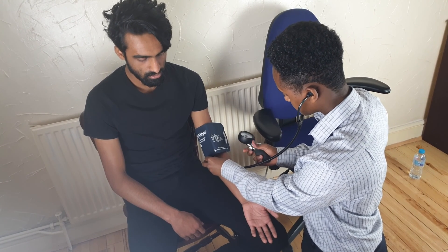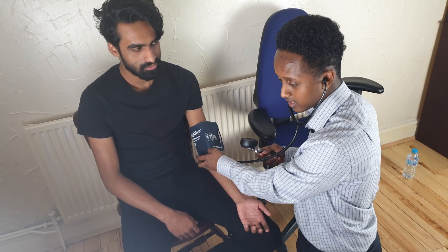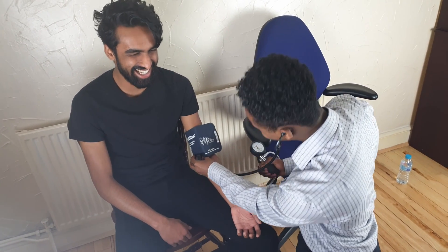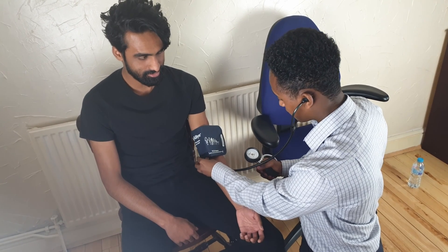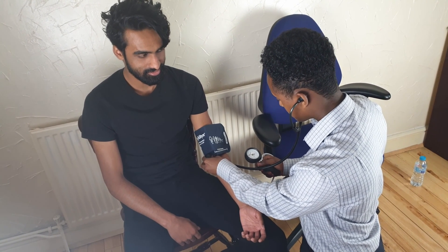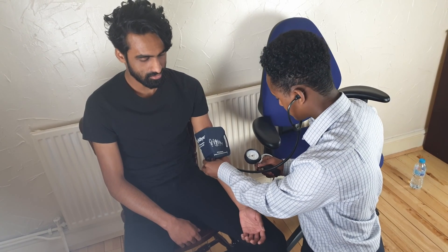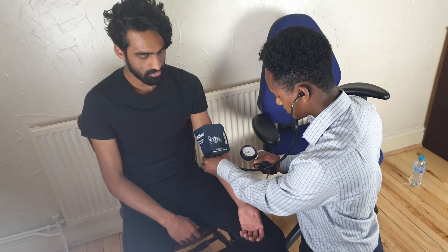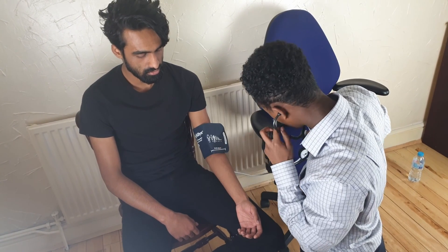Turn the notch as before and make sure you warn the patient because it can hurt a little, especially if they're slim. Inflate the cuff — I'm going to inflate it to around 140. I hear the systolic value around 120, which is a really good healthy systolic pressure. I'm going to slowly deflate the cuff until I don't hear the sounds anymore. The blood pressure for Nick today was 120 over 60, which is coincidentally perfect in regards to NHS recommendation.